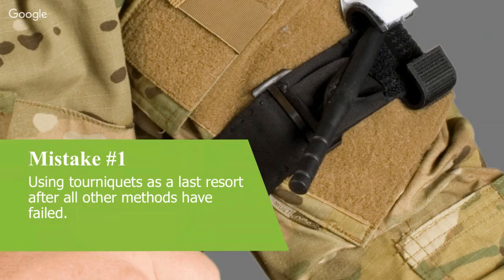So we want to get these tourniquets on early, but again, we can't step outside our guidelines, depending on where you are. If you work for an EMS service or an ambulance service, then sometimes you have to go through direct pressure and other indirect pressure methods before applying a tourniquet. Dan, we were talking about even as of January last year, with the recent Australian Resuscitation Council guidelines, that they're still recommending it's a last resort. What are your thoughts on that?